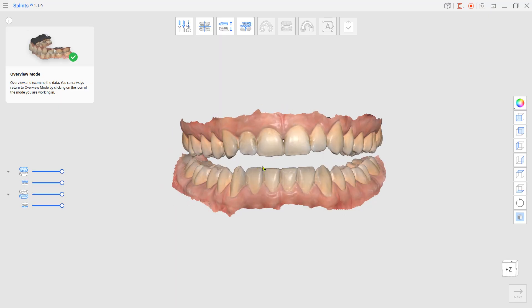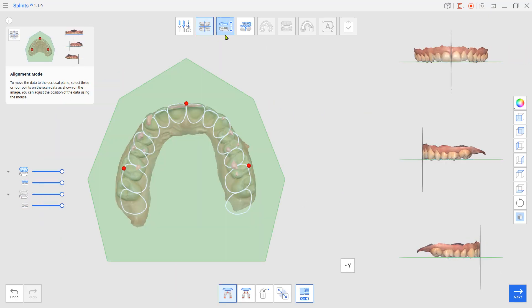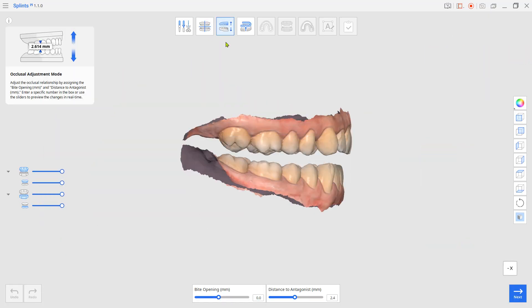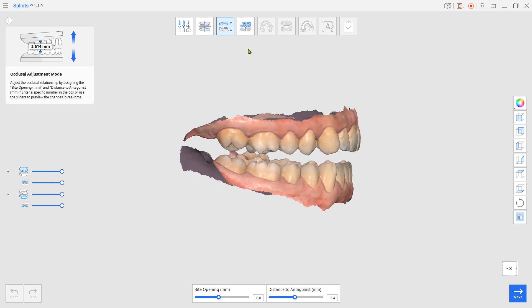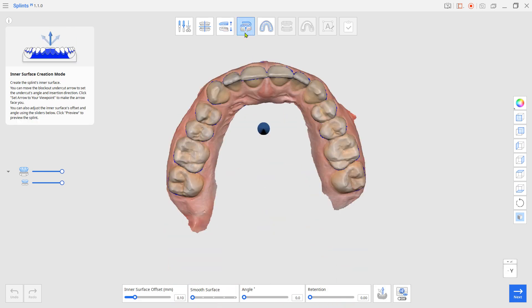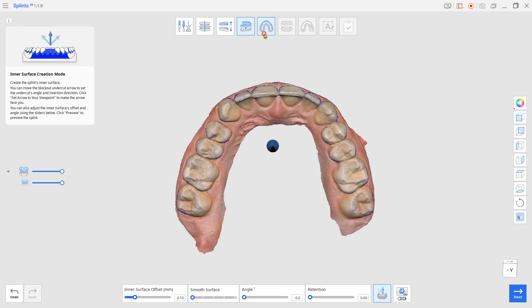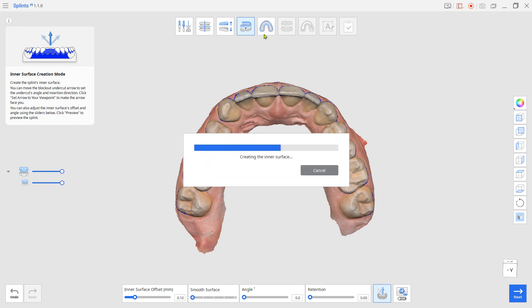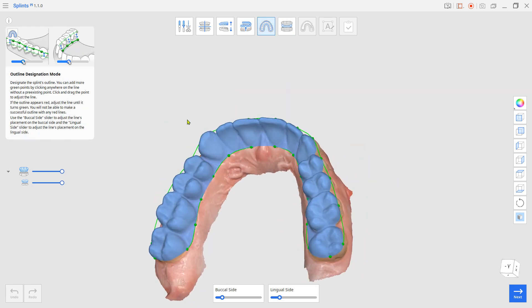Set up the teeth along the process. Set the inner surface offset and insertion path. Adjust the margin if needed.